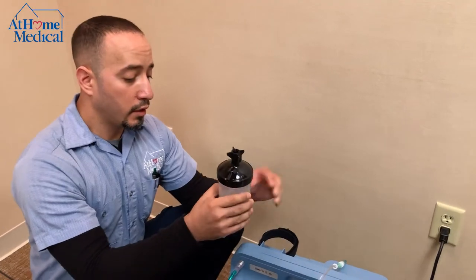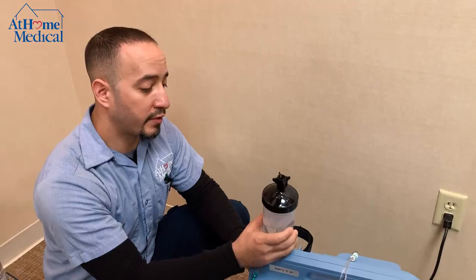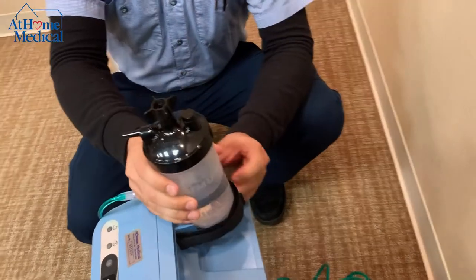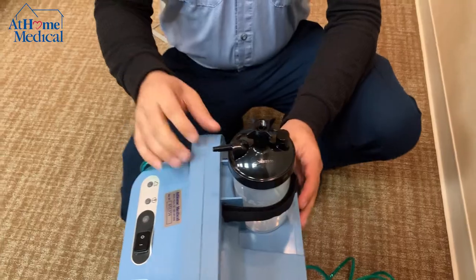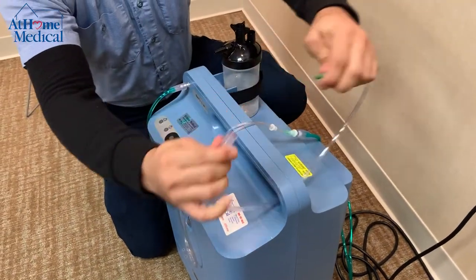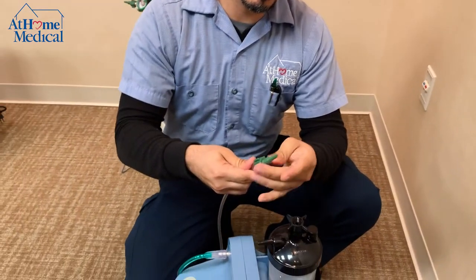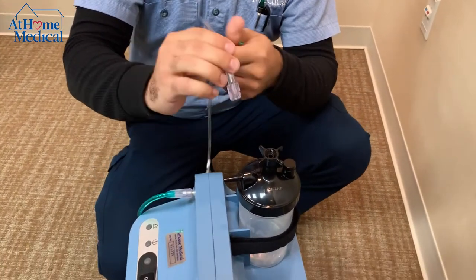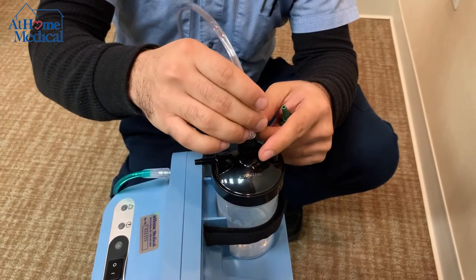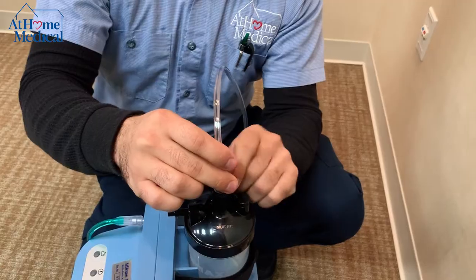Most units have a location to install your humidifier bottle. On this one, you would strap it onto the back. You'll have an adapter — a piece of tubing that you connect to the top of your humidifier bottle. The top of the bottle has a swivel threaded screw which attaches to your tubing adapter.